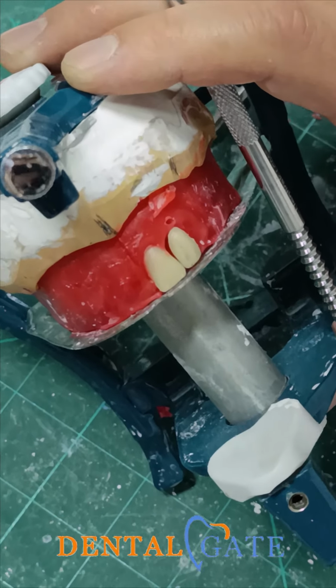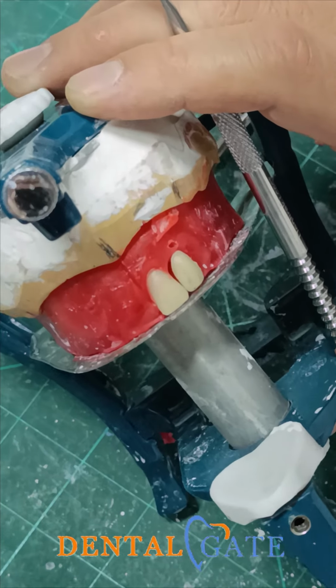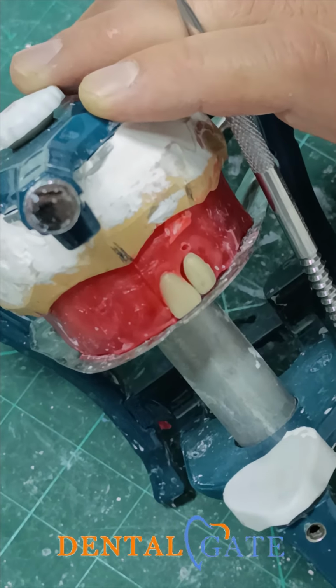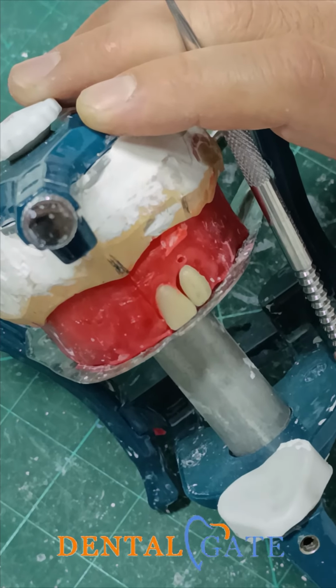Why do I make this criteria? Not for aesthetics only, because I will apply this rule to the anterior region for the upper and the lower, and the posterior region for the upper and the lower.